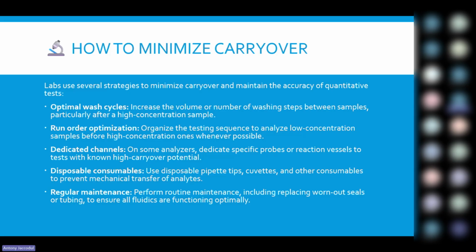So if you know clearly that the samples you're having are maybe from a patient who might have a previous history of the same disease, you need to see how those particular samples are run in the laboratory. That's why whoever is running samples, whether in clinical chemistry, immunoassay, hematology, cardiology, or even coagulation, you should be able to concentrate also on the patient history.